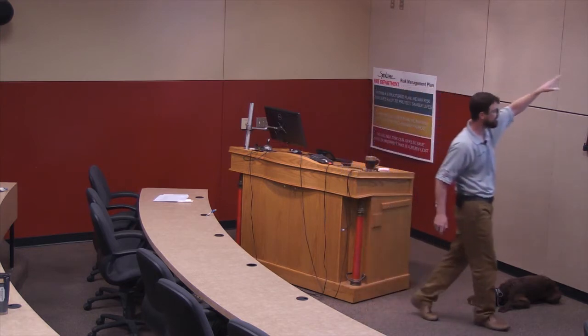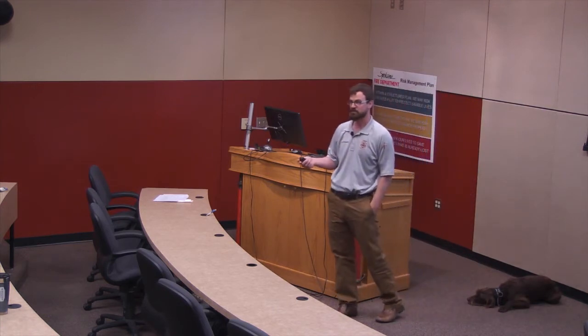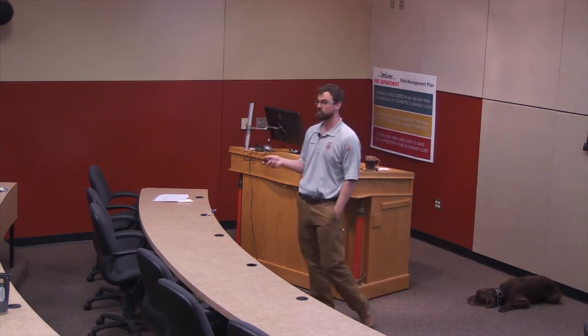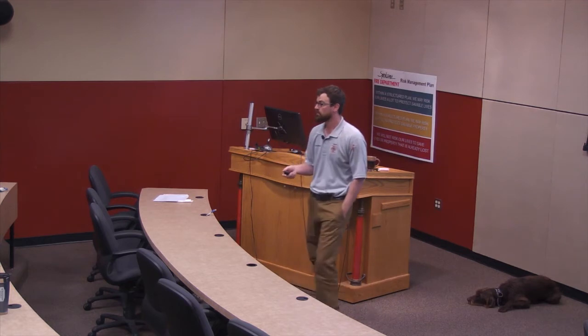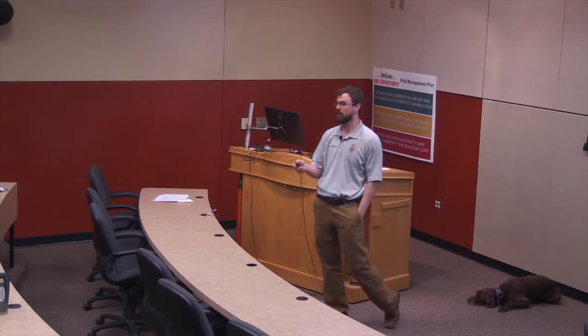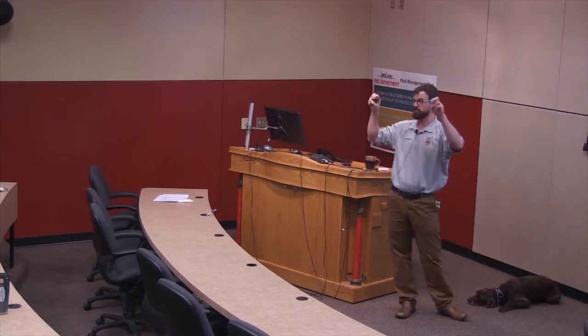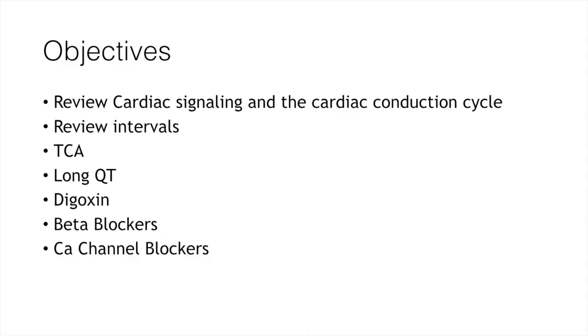Let's talk about tricyclics, which are really sodium channel blocking agents. We gave a bunch of depressed people tricyclics in the 80s and they decided it's a wonderful thing to overdose on, right? So they popularized the sodium channel cardiotoxicity. But there's a lot more than just tricyclics that can cause a sodium channel blocking effect, okay? So we'll talk about sodium channel blockers, the tricyclics. We'll talk about long QT drugs. We'll talk briefly about digoxin, and then beta blockers and calcium channel blockers, okay?